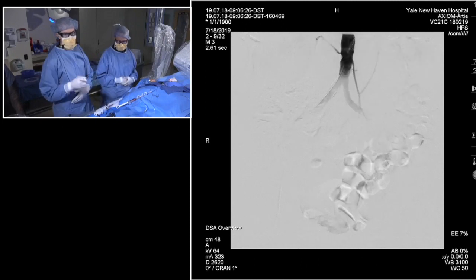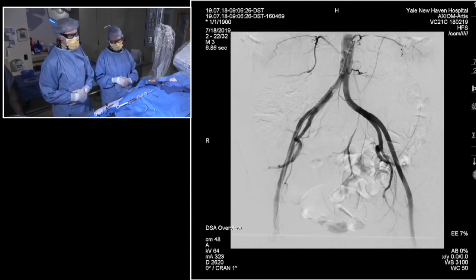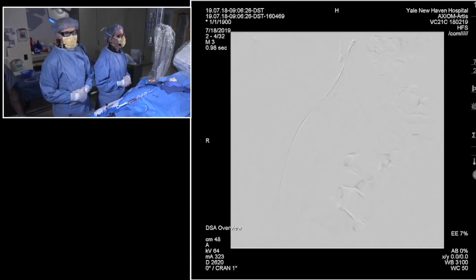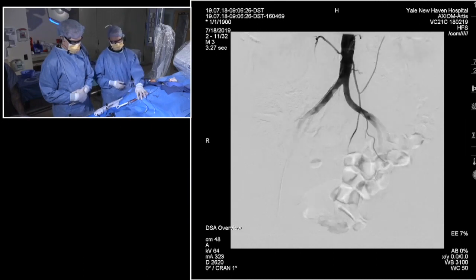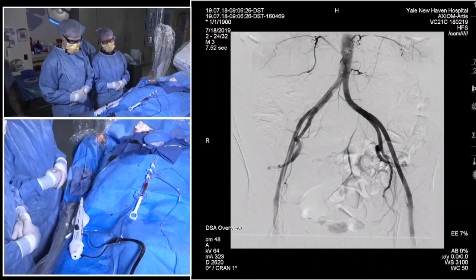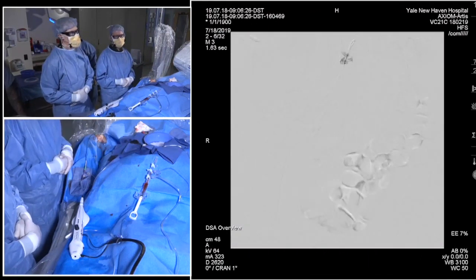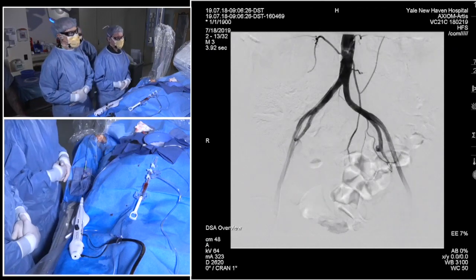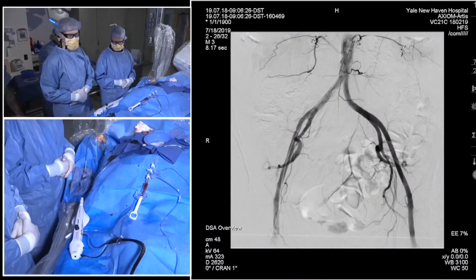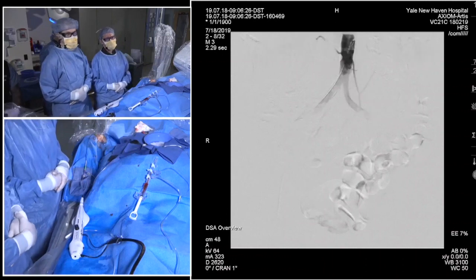Right, so as you can see here in the picture, we did that, and there's not much disease there at all, but the size is really suboptimal. So we're actually all set up here. What we did is we took a workhorse wire and a microcatheter down the LAD, as we've been talking about, and flipped that out for a floppy RotaWire. We brought a 1.5 burr up to the guide tip. We're going to need to start rotoing from the guide into the left main, as you can see. I'm going to go to the next picture.